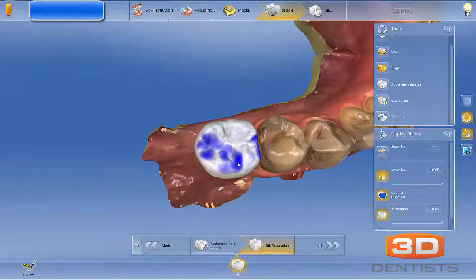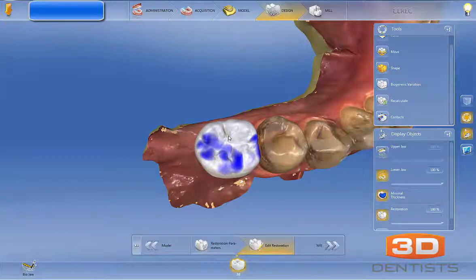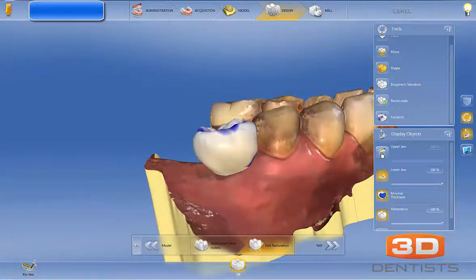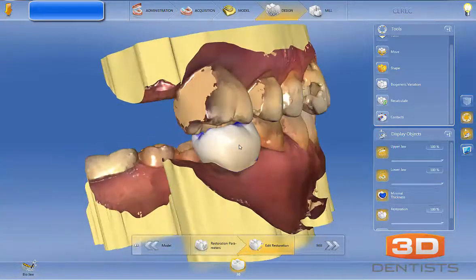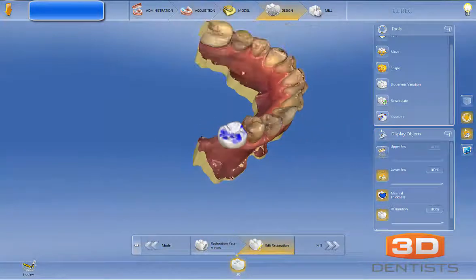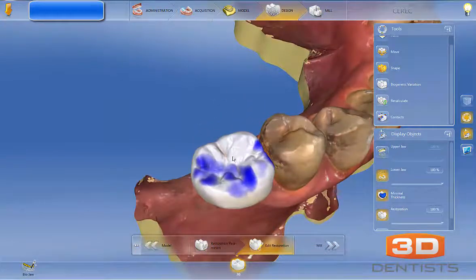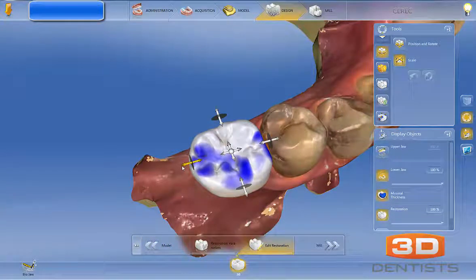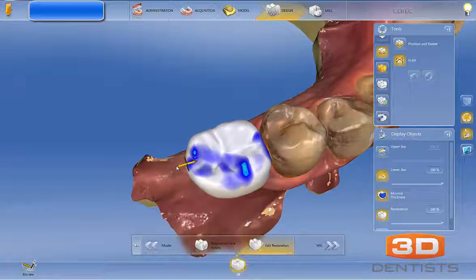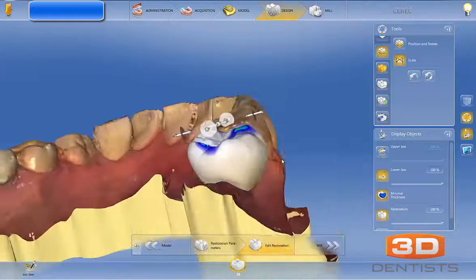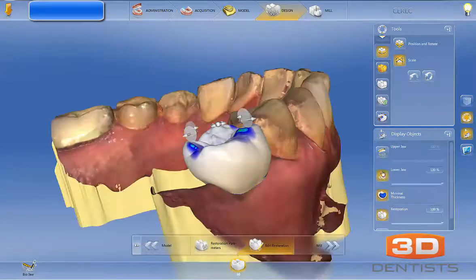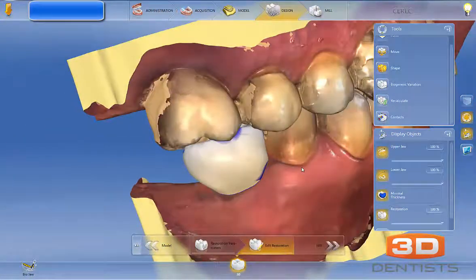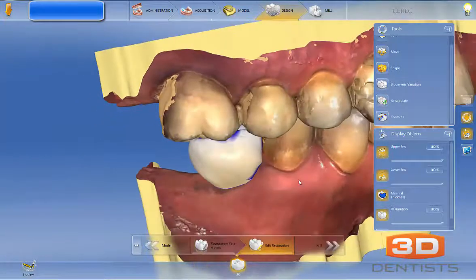Buccal-lingually, the correct width is important so that we know we need to put the implant centered right here versus back here — if our tooth width is incorrect buccal-lingually, that is no good. The last question in this case is does this tooth need to be wider mesial-distally, and the answer is quite honestly probably yes. We can use the scale tool to adjust that — just like so — and now the width of the tooth is more accurate. Hopefully this has been helpful for you, and thank you very much.